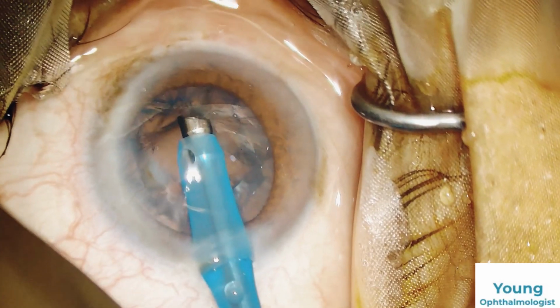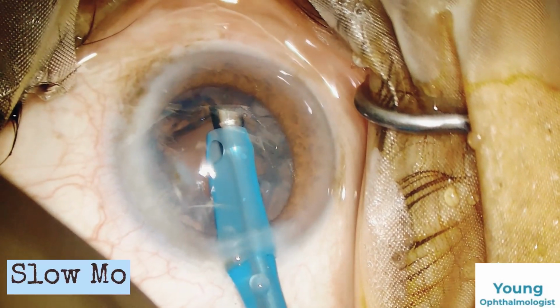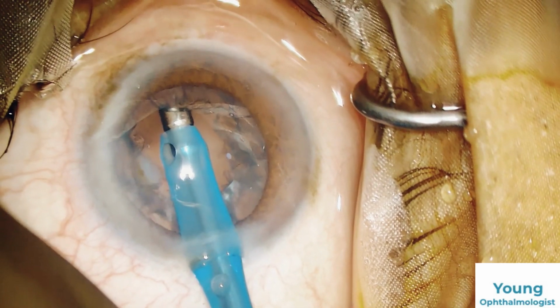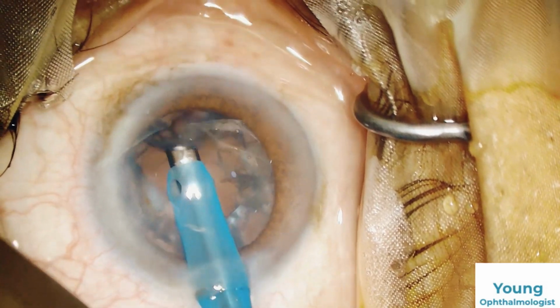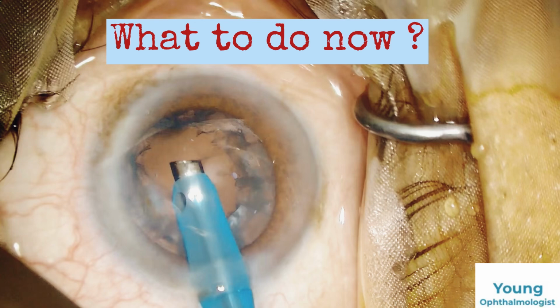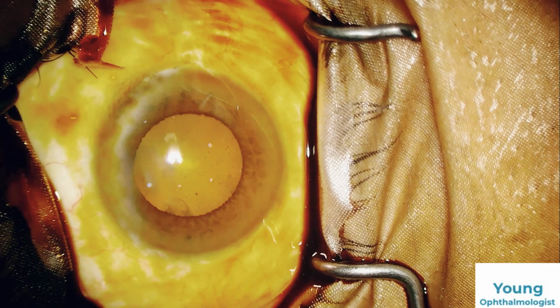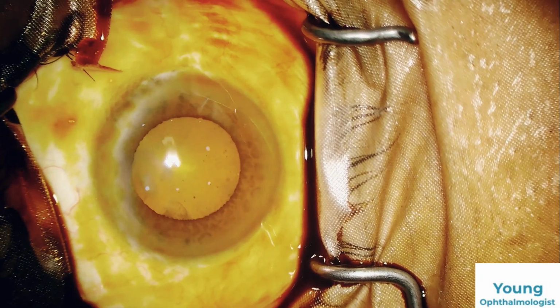Hi friends, sometimes we face this situation in Phaco 3 as I am trying to aspirate the epinucleus. I am not able to do so. What to do now? We will see in this case. So it's a routine case, grade 2 cataract.